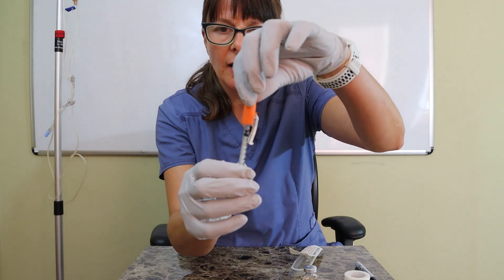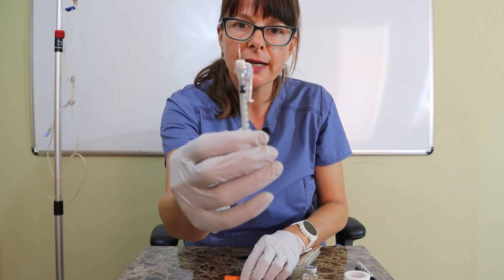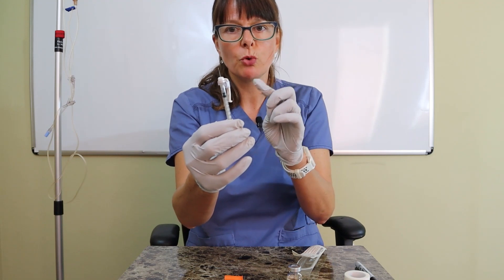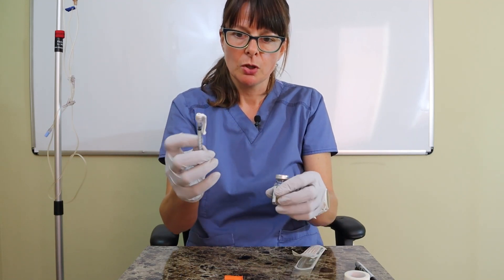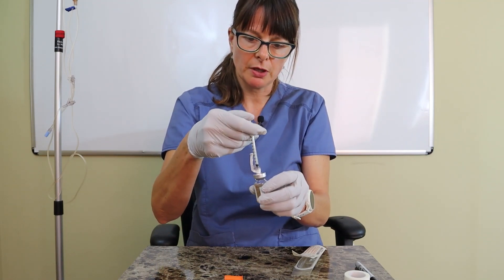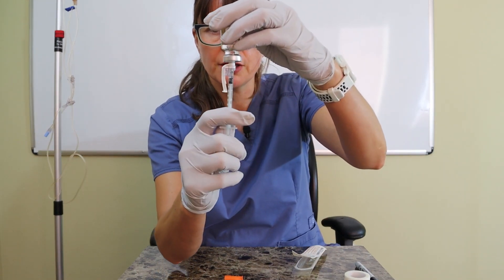When uncapped, you can see that the needle is tiny and very thin, so you have to be careful not to move it to the side because you can bend the needle quite easily. I'm going to insert the needle, push in the air, turn it around, and withdraw the 10 units.